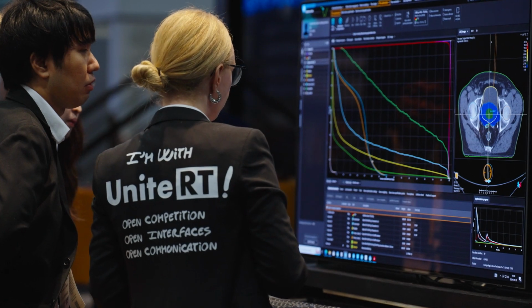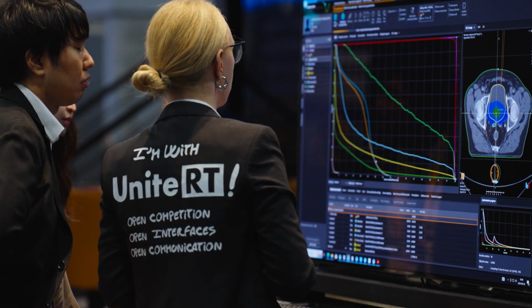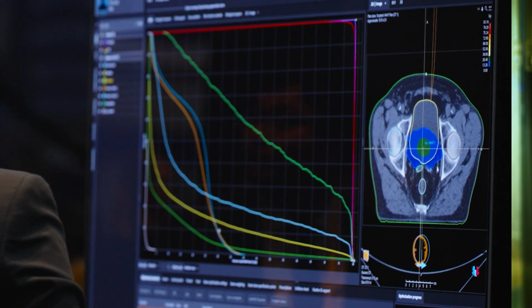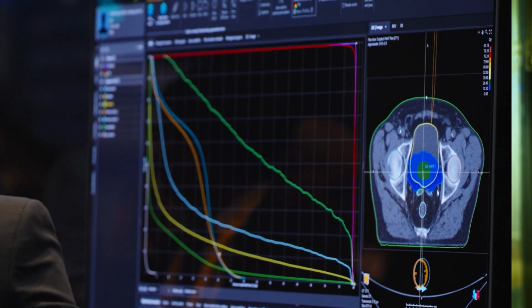There are definitely examples already today where we can do it. Prostate is obvious. You also have breast treatments. We can automatically segment the node volumes as well. As long as the clinic has specified how to define the target volume based on the different node level stations, this can be automated. Deep learning will come in and segment every node level individually, and then there is a template saying how to combine them into a target volume. It can all be automated, but under the control of the clinic for how they want to do that. I would say the same goes for head and neck and the lymph nodes there.